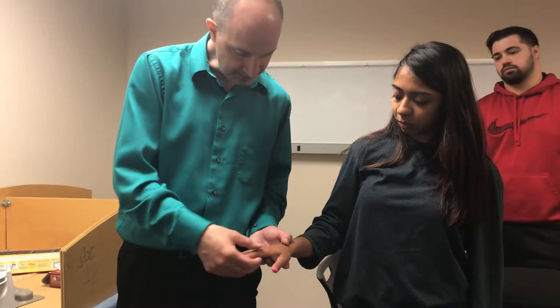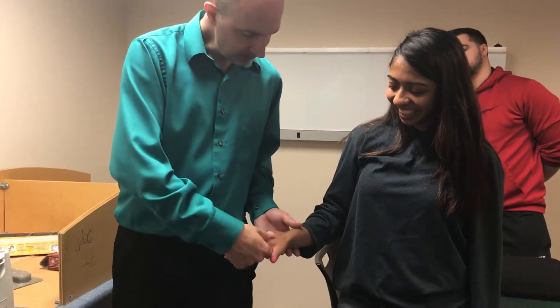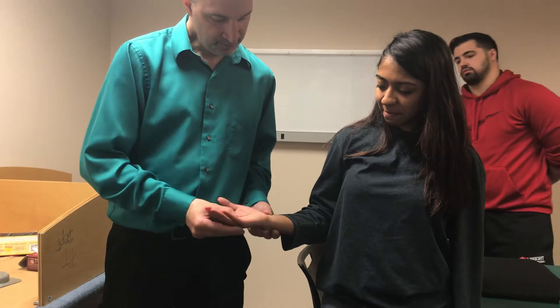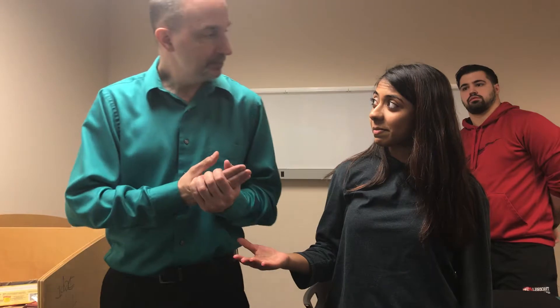Next I'm going to inspect the skin. This knuckle's a little bigger but nothing else. I looked at range of motion: supination, pronation, flexion, extension, and radial deviation. So what's my contraindication list for paraffin?